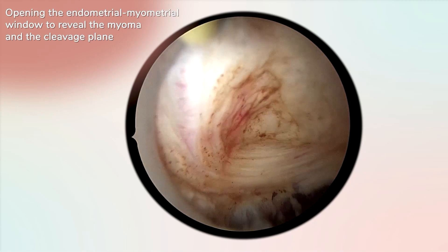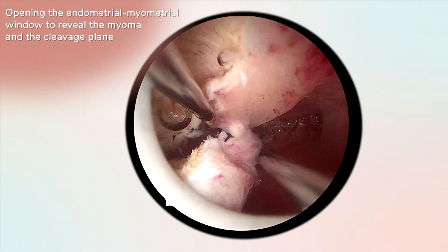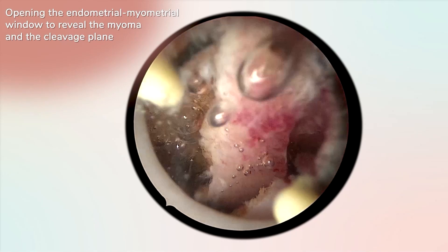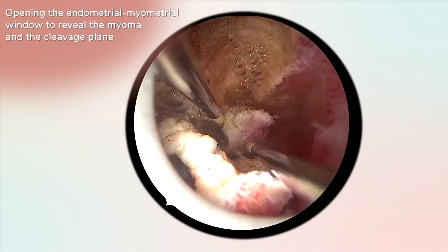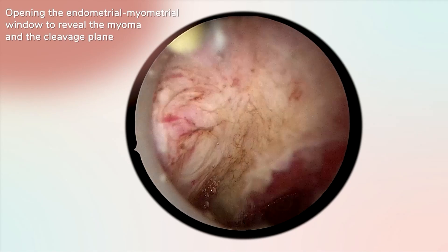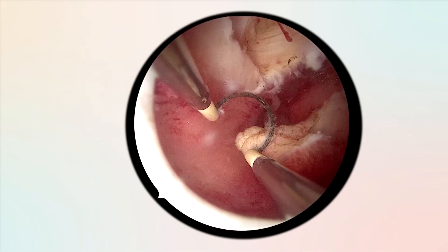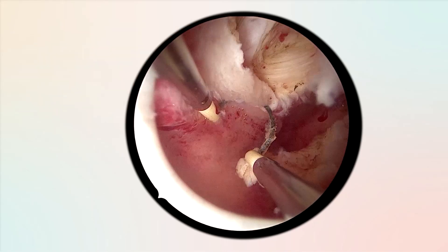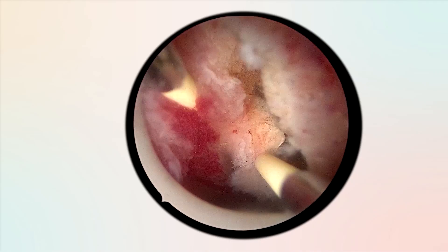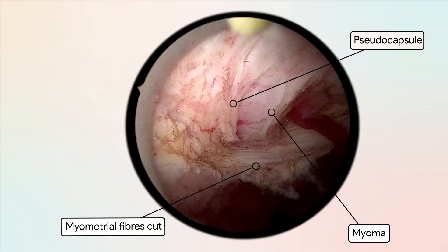The procedure begins by creating the endometrial-myometrial window with the goal of preserving as much myometrium as possible. Once this window is opened, a clear view of the myoma, the cleavage plane, and a few millimeters of the cut myometrial fibers becomes possible.